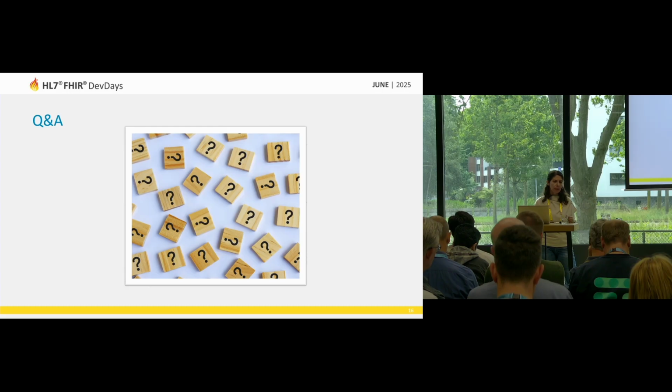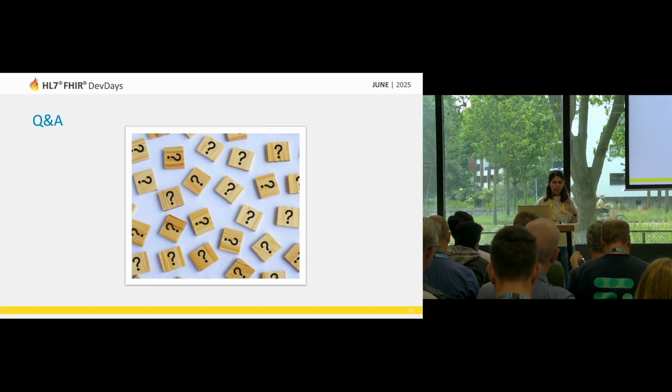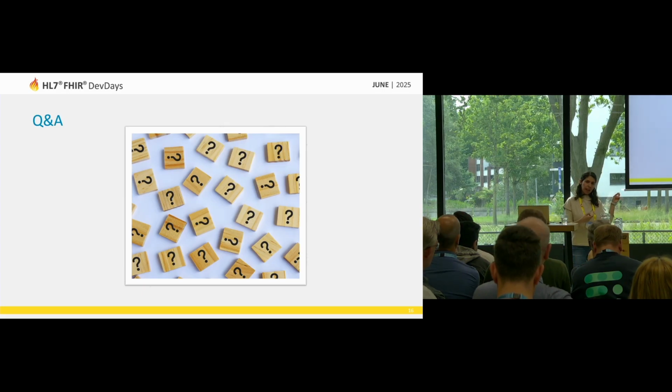I still believe that at least this section from the findings needs to become more structured, or at least in the back end. So still the doctor should be able to dictate their whole narrative as they do, but behind the scenes, we need to capture this data in this structured format. And for me, the way to go is with the observation. Sometimes it is also a little bit tricky with this assessment. So do I put it inside the interpretation of the observation? Do I put it there? Do I use the clinical assessment?